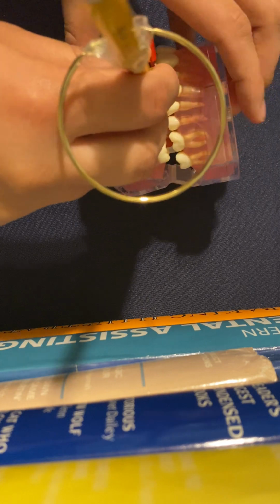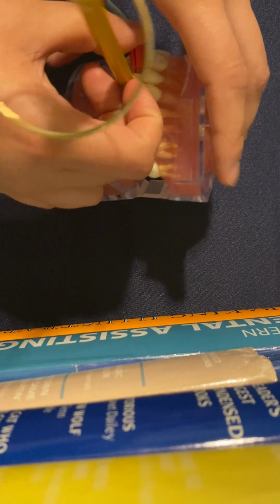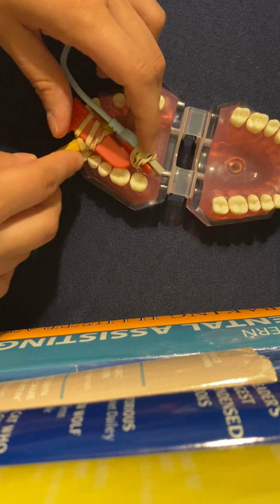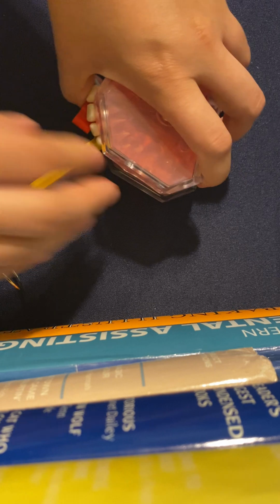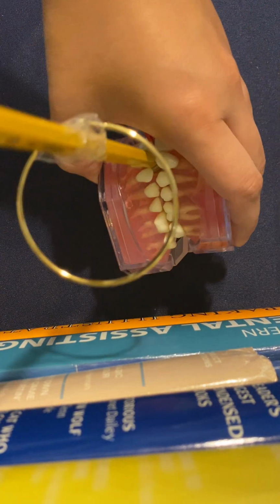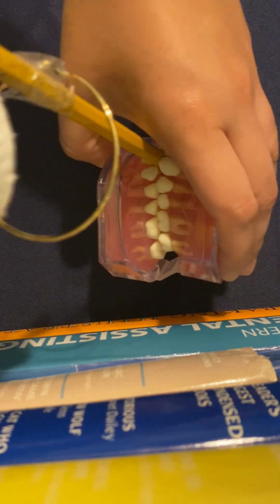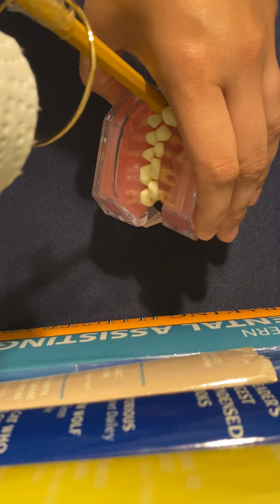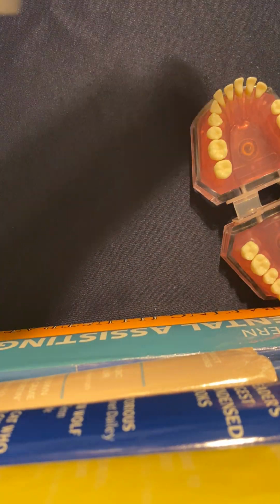So let me just line that back up for you. Oh, there we go. That doesn't point out like that. You want it more pointing in. Let me try to get it a little nicer for you. It's biting on that pencil, so he doesn't like that. Like that. So you've got that nice area like that. You're going to want to point down from the outer corner of the eye to the occlusal plane, kind of around there, flat.